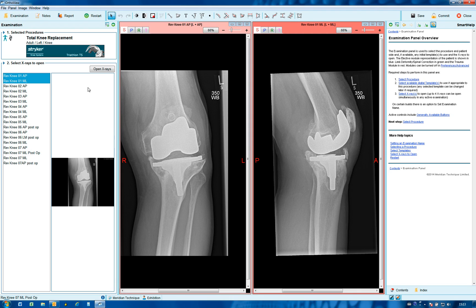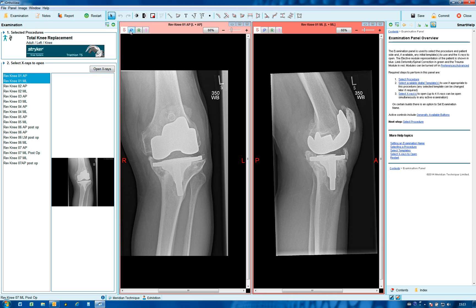We've already pre-selected and positioned as if we were doing a total knee replacement, in this case on short knee images. The procedure has been selected on the blue man — a total knee replacement on the left — and a template has been selected. Two images have been opened and they've been scaled.